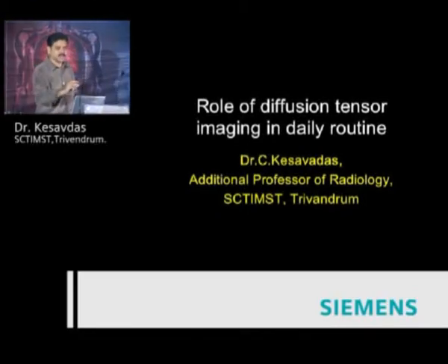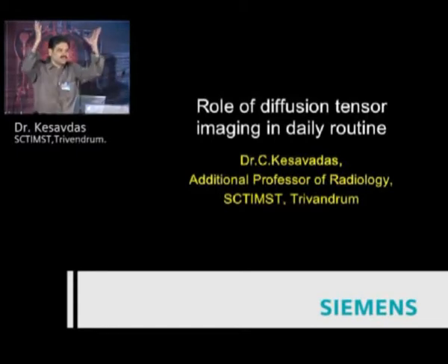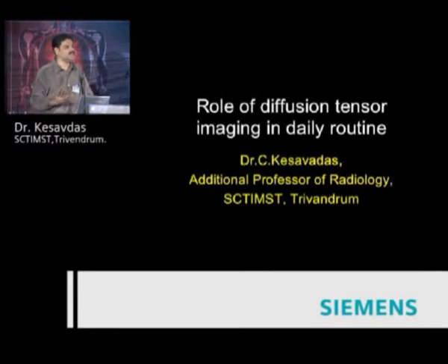So we'll go to the next talk on diffusion tensor, about which we had some discussion yesterday. And the last one, what Dr. Kohli showed was a picture with a lot of wonderful figures. It's not what we think is DTI.